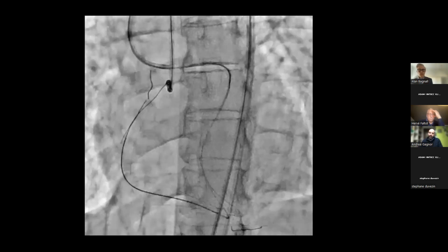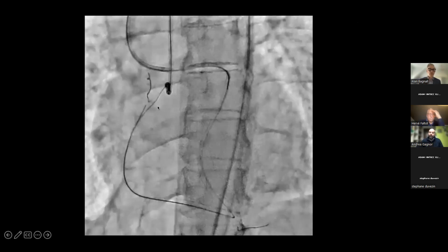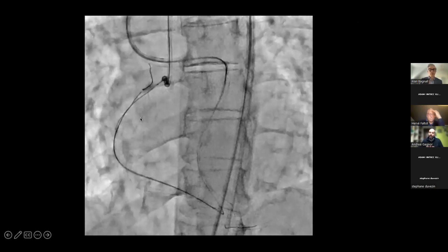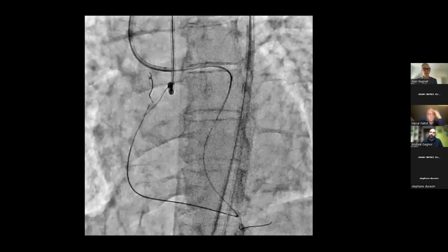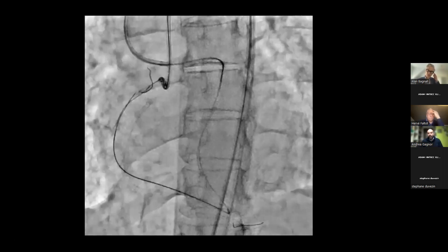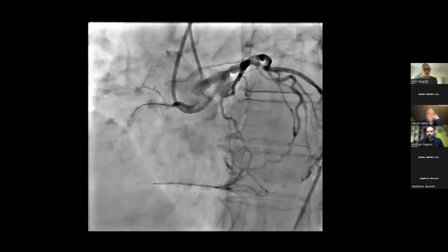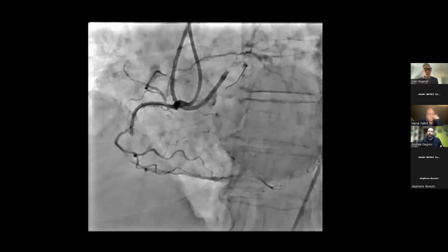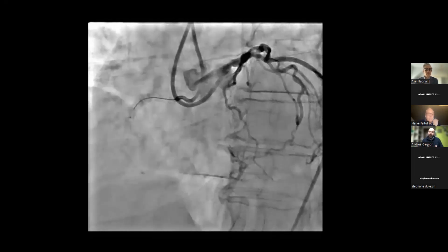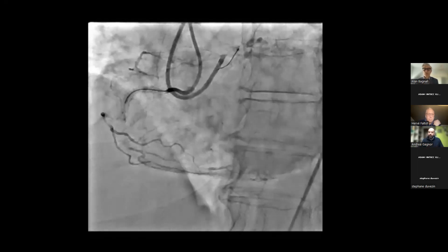So they are very good in antegrade fashion, they are very good in retrograde fashion, but once again, you have to have a clear target where to direct your wire in order to be very precise. Otherwise, you're just poking with the tip of your wire and advancing it without having any kind of advantage with this wire. To solve this problem, there are specific anatomies where the anatomy is not very clear. We already thought that you can drill your wire and advance, creating some kind of space in the space of minor resistance.